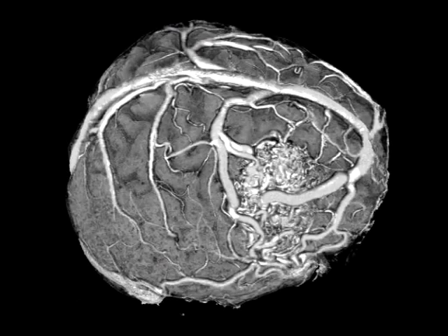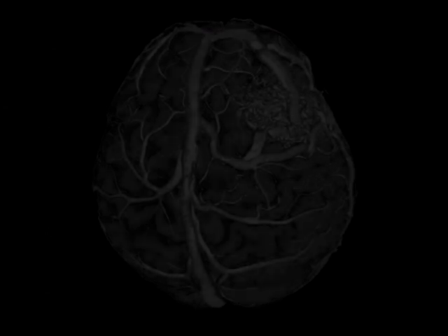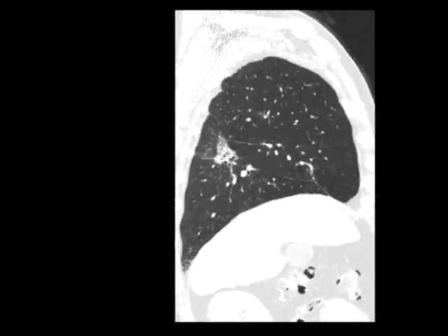The multi-slice scan using contiguous thin slices is fundamentally changing the concept of CT. Thin slice isotropic volume data acquired at high speed permit CT to replace angiography or plain radiography.